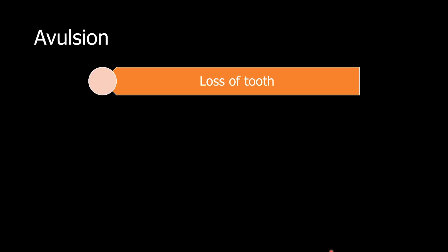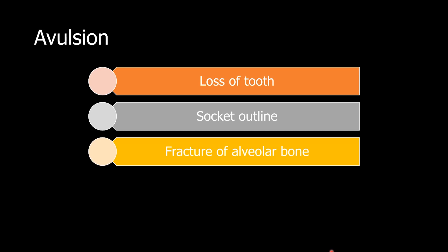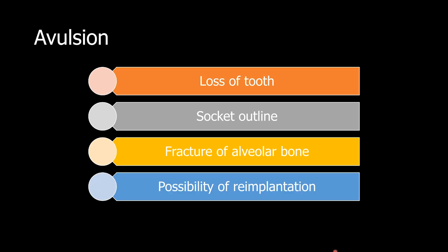Avulsion can give us the following radiographic signs: the tooth is lost and there would be a socket outline. You have to look for the intact socket outline and for any fracture of the alveolar bone. These features are evaluated for the possibility of re-implantation of the tooth. In our case, the patient had re-implanted the tooth himself with some kind of success.